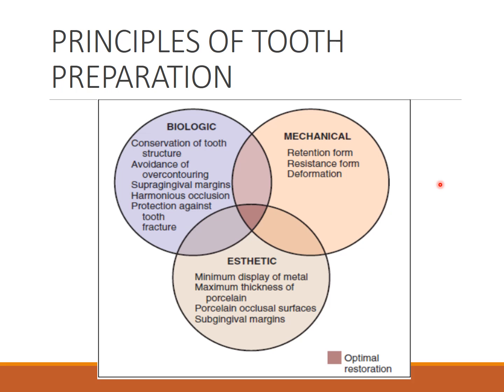There should be some structural durability. The restoration should contain some bulk of material which can withstand the occlusal forces. So all these things come under mechanical preparation, guys.